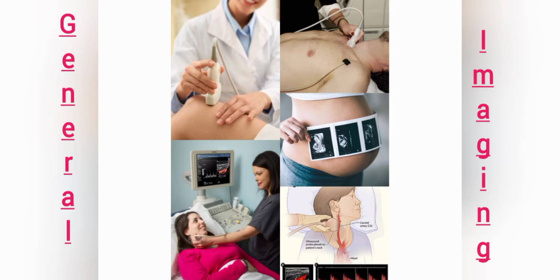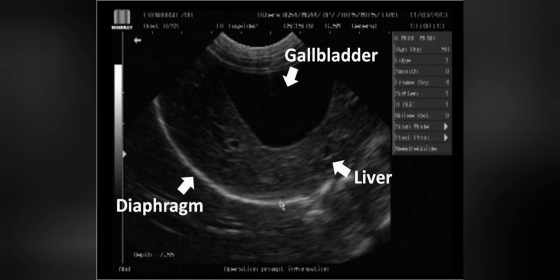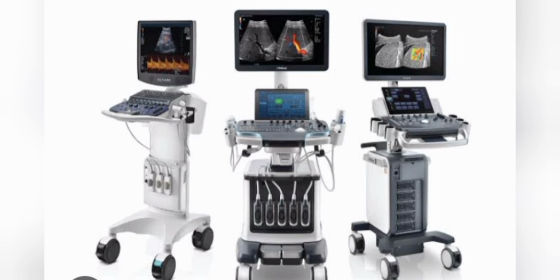Next type is general imaging ultrasound machine. This type of ultrasound machine covers wider range of applications. They cover abdominal, musculoskeletal, urological, small parts, vascular and yes, also obstetric and gynecology studies. Just one should have that particular probe for respective examination, because many general imaging systems are upgradation friendly to share services. Just need software upgradation and that particular probe. So those all types of machines work best in safest way.